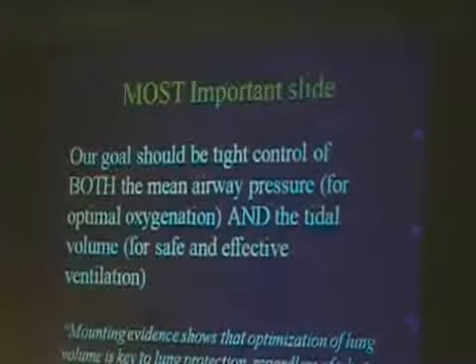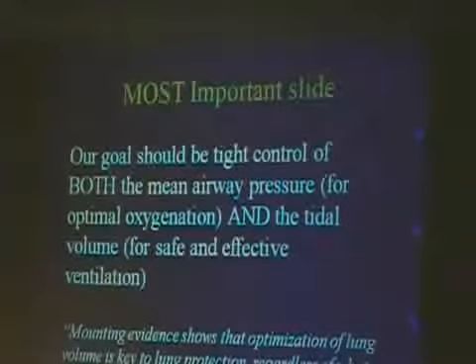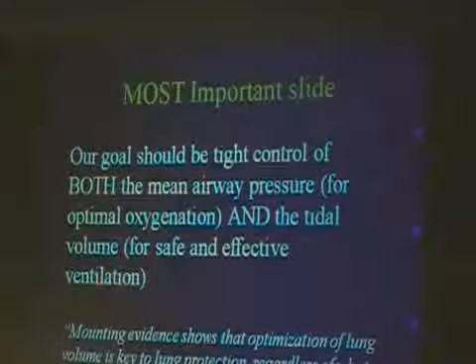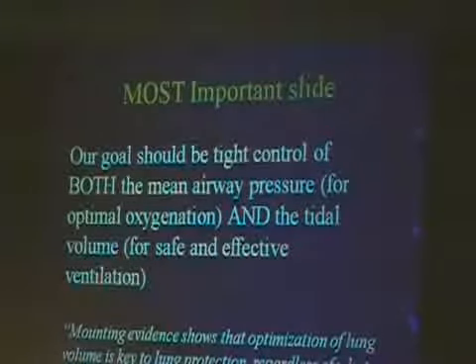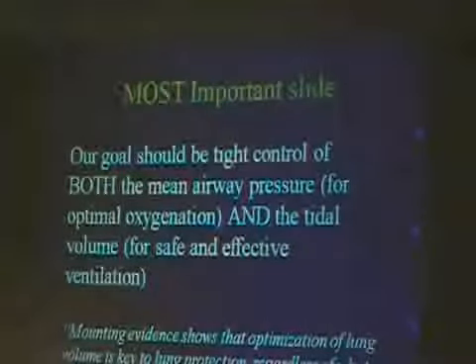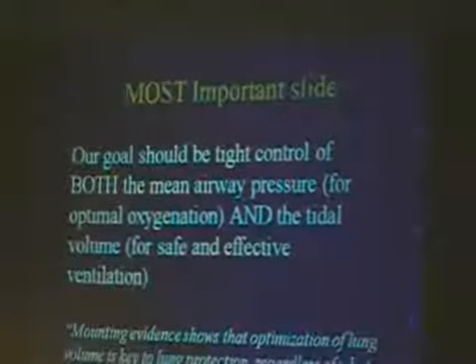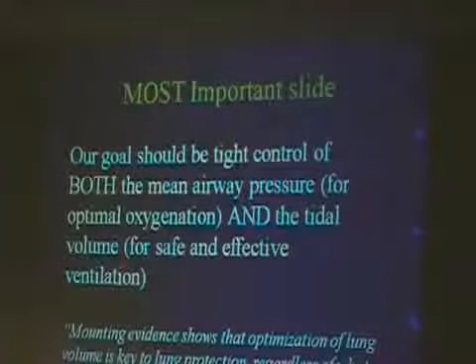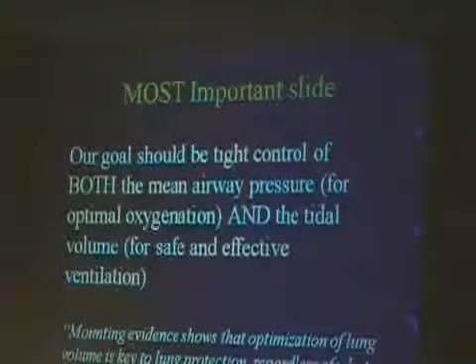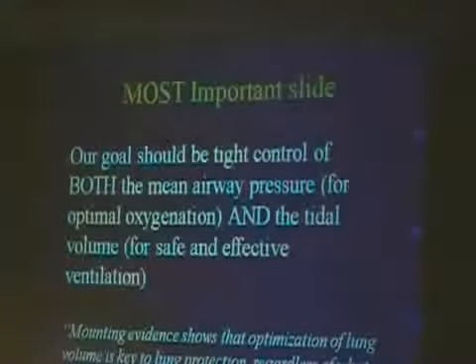So, most important slide, everybody that's fallen asleep, wake up. Our goal should be tight control of both the mean airway pressure for optimal oxygenation and the tidal volume for safe and effective ventilation. And I took a couple of quotes from Marty. Mounting evidence shows that optimization of lung volume is key to lung protection, regardless of what ventilation mode is used. And I think this just can't be said better.